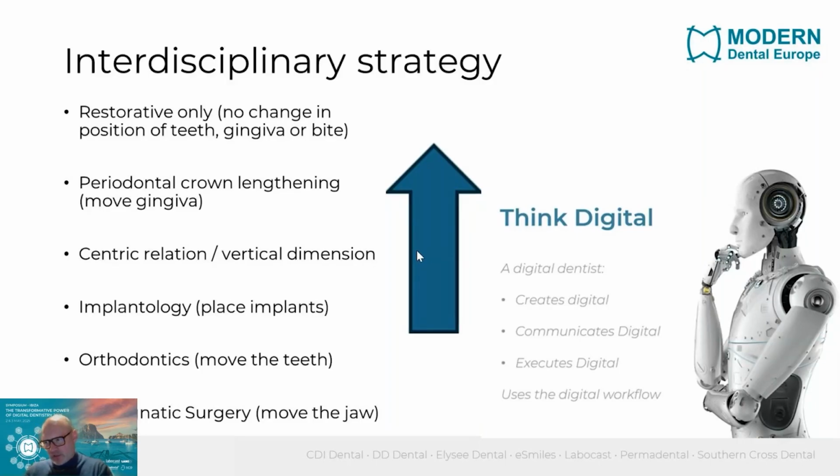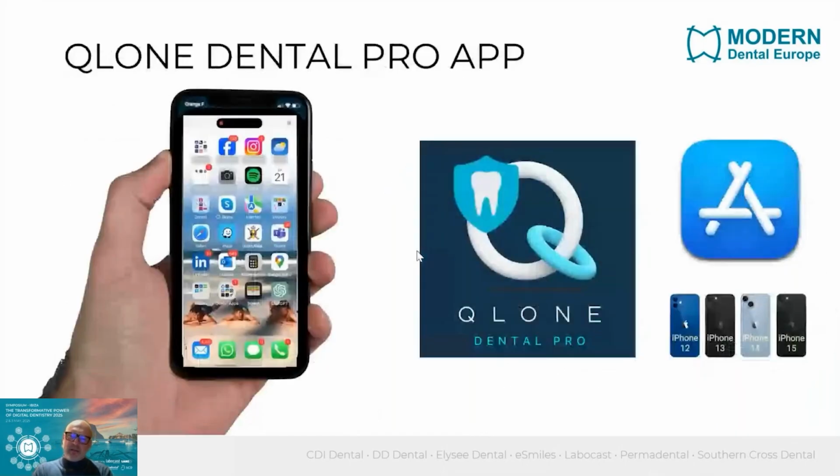This is a tool which really helps us to finally come from the CAD, the design, towards the manufacturing, the CAM, so after approval we can convert to CAM, which means execution, production, and finally milling or printing or whatever to produce the final solution.